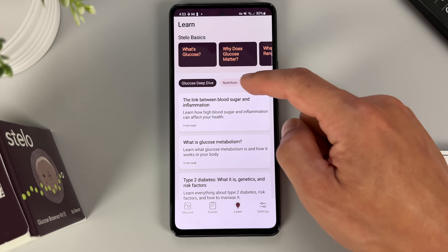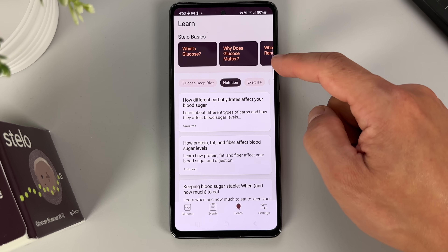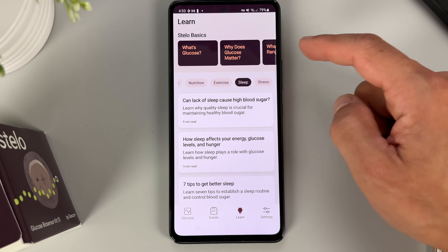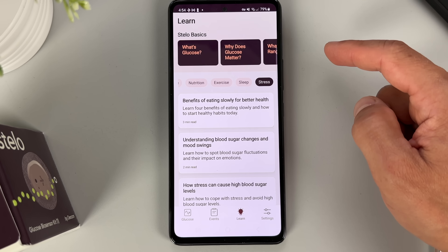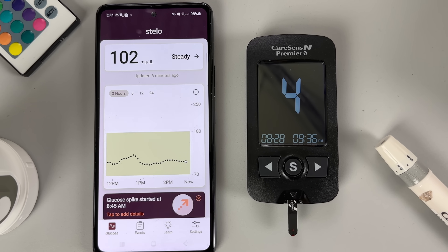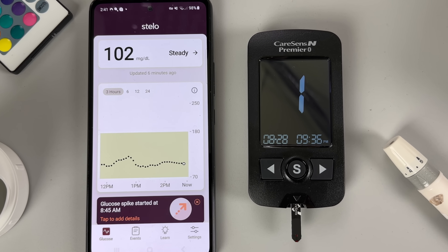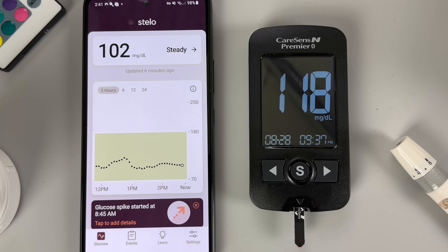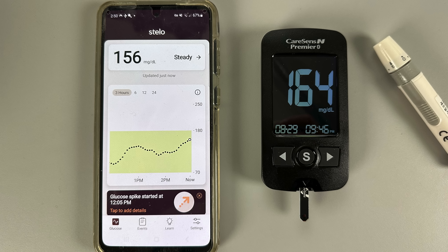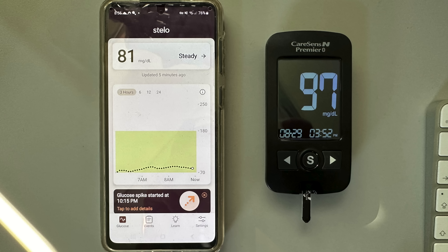The positives don't end there. The app also has a helpful learn section with a ton of information about how nutrition, exercise, stress, and sleep impact your glucose. Now I'm sure you're curious about accuracy — how the Stello readings compare to finger pricks. I have good news: we did several control finger pricks and checked the Stello readings against my glucometer and they were never too far off. From my experience I would say Stello is just as accurate as Dexcom G7.